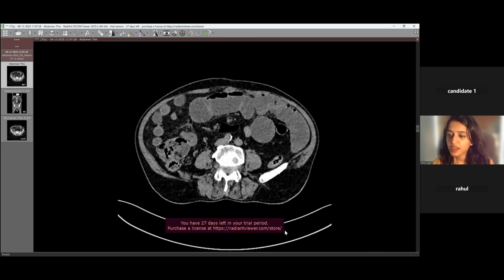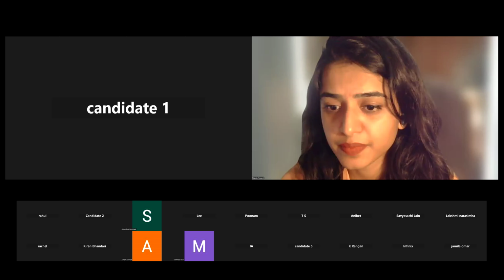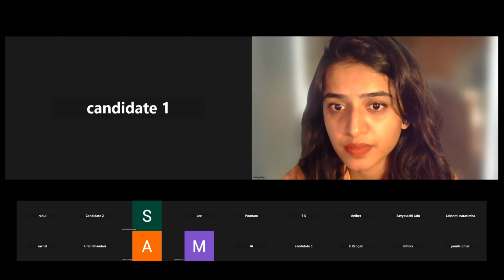Great. Yeah, this is your next case. So this patient comes with lower back pain. It's not on the screen.